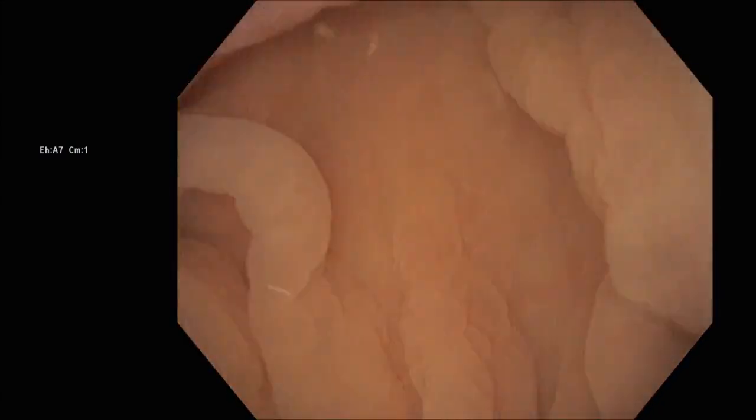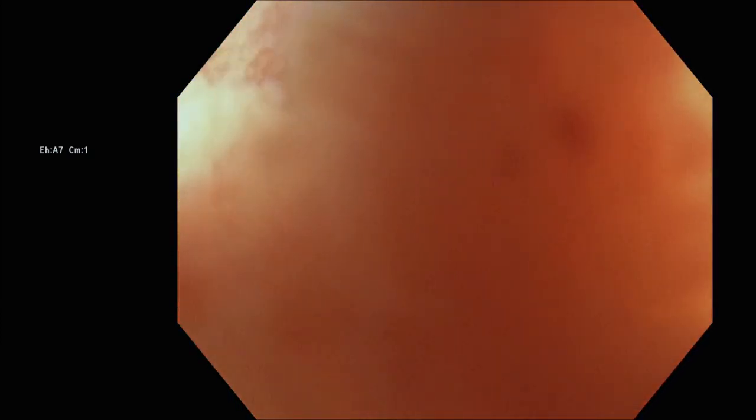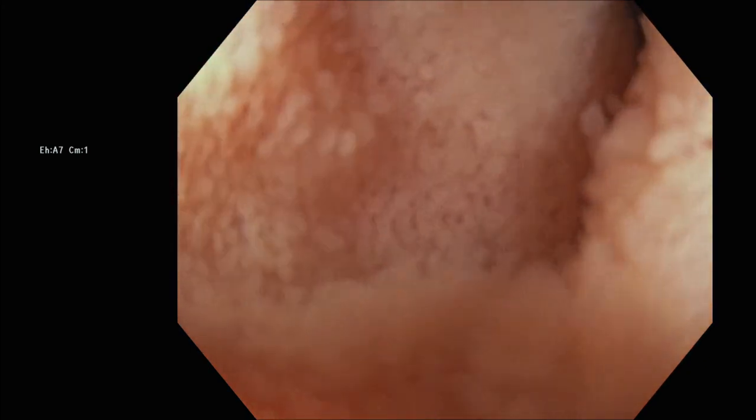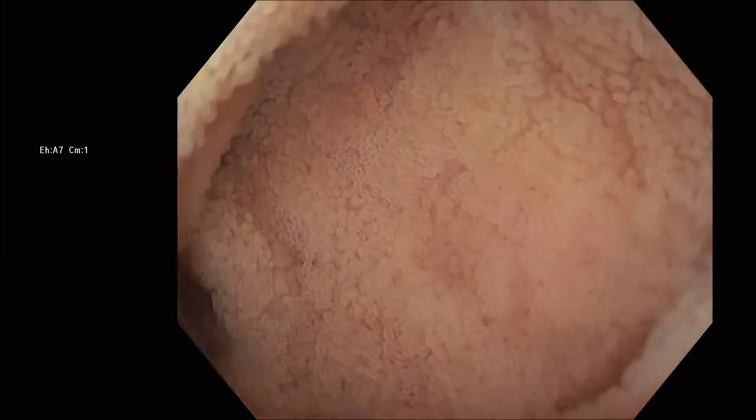It's turned away from us a little bit, but when we get under there, it actually is quite easy to turn into the valve lips. And again, I think the water technique seems to make the valve orifice a little bit more receptive. It's easier to push through a large scope, an adult scope, with a device on the tip.